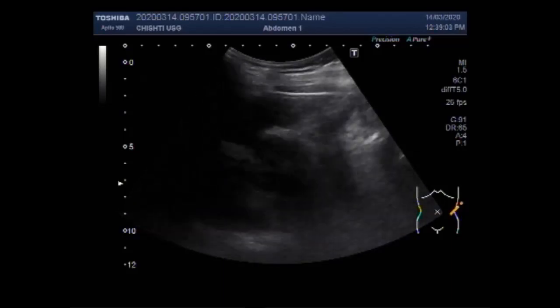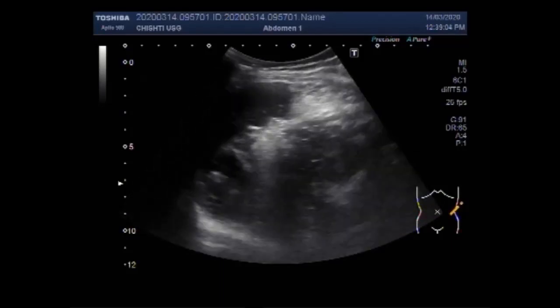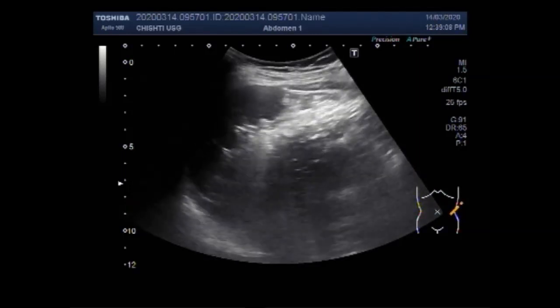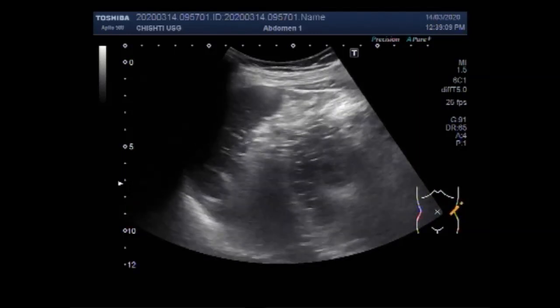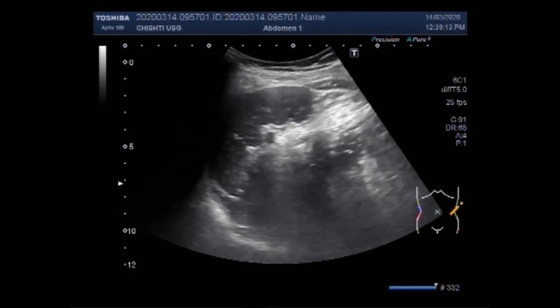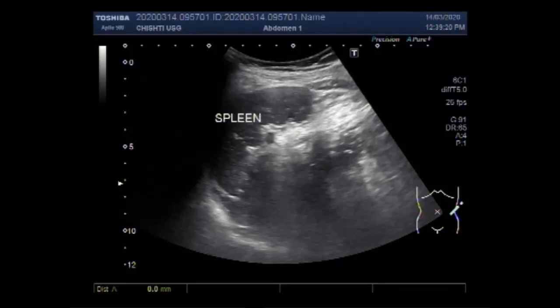This is the liver and this is the spleen, along with the left kidney. You can see the spleen is of normal size and shape. There is no metastatic lesion seen in the spleen, and it measures about 8.2 cm in the long axis.